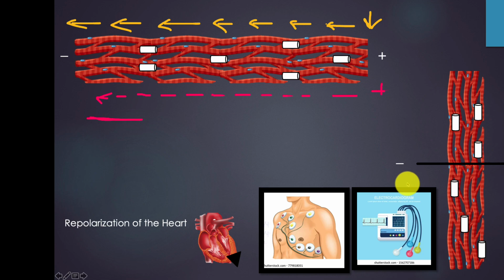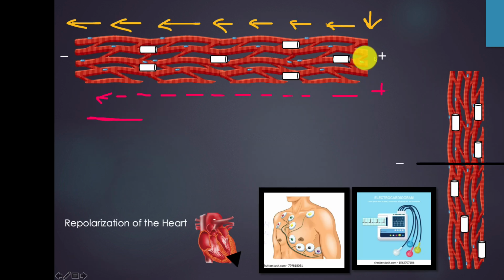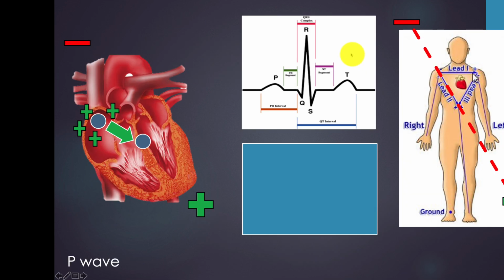So 2 out of 12 is pretty important. And what happens here is lead 2 usually starts up here on the arm and then usually ends down here on the leg. And how the electrodes work with that lead 2 is we get a negative electrode to a positive electrode, right? So now you're like saying, oh, I get it. Now he's talking about positive to negative and which direction the charges are going. So hopefully that is starting to make sense.